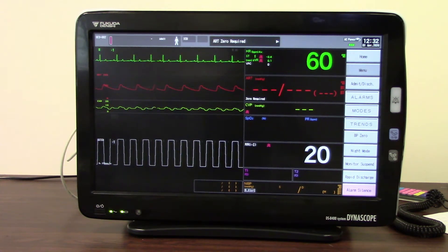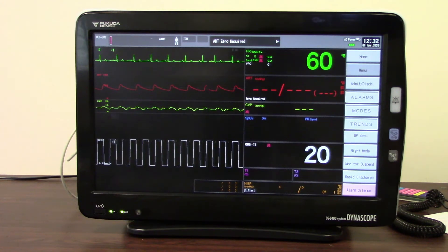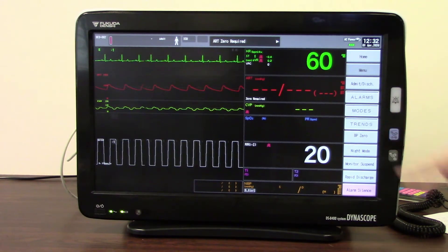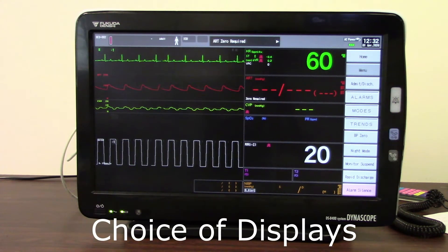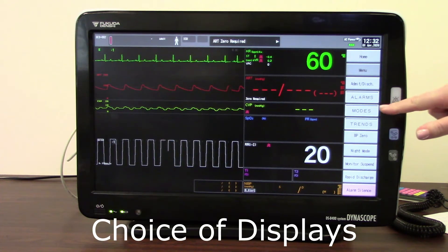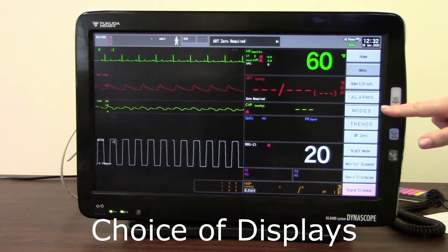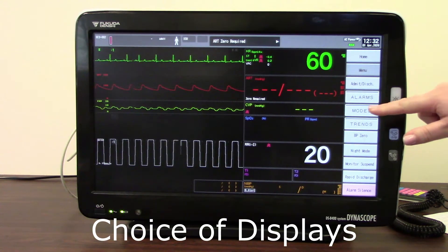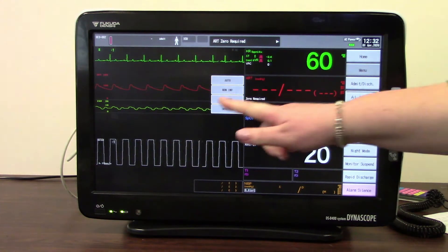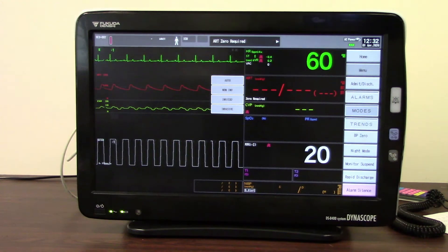To begin with, we're going to look at the various display options that you have available. It might be that yours are part of your user key setup, or you may have a stacker menu like this one, which is called modes — it equally could be called displays or something similar. If you just touch, you can see that it will bring up the choices of displays that we have available.